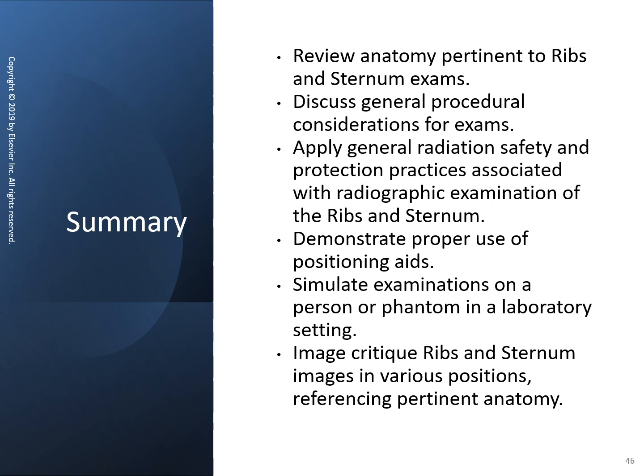You can give it a try, but they are going to have to shimmy up to the vertical bucky, kind of lean into it for that sternum exam sitting. But it's perfectly acceptable to do a sternum exam sitting if your patient is too tired to stand. We will do simulations of these exams in practice, and then we'll review them as we go into the skull.